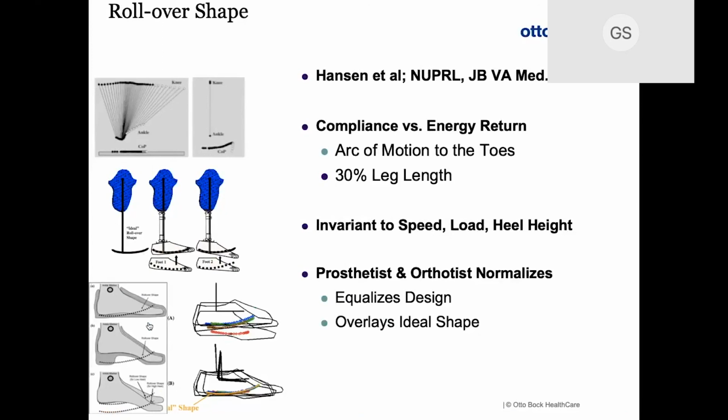And what's interesting is the prosthetists and orthotists, we've measured this, or Andy Hansen actually did. He measured this and he found that what orthotists and prosthetists try to do is normalize this arc. Anecdotally, this is something that you see and try to emulate cosmetically.